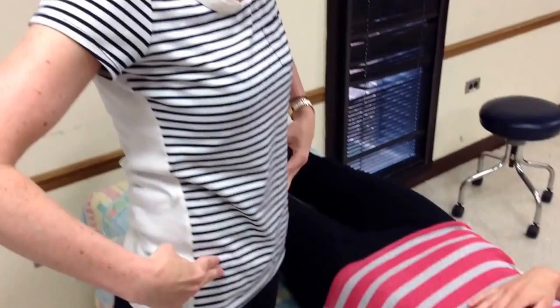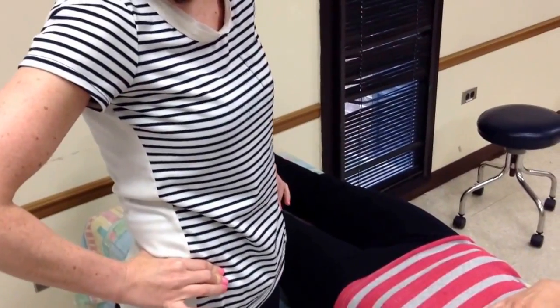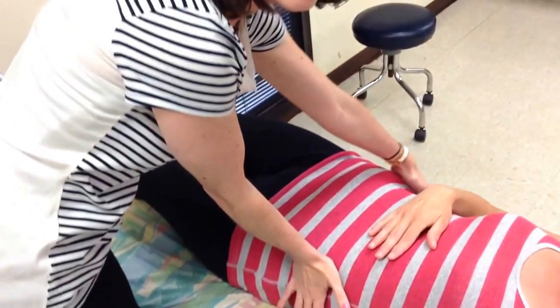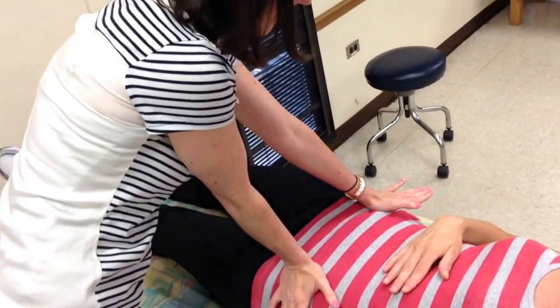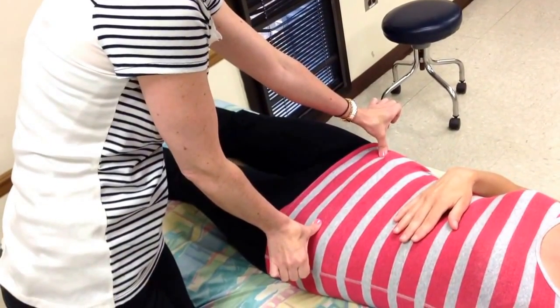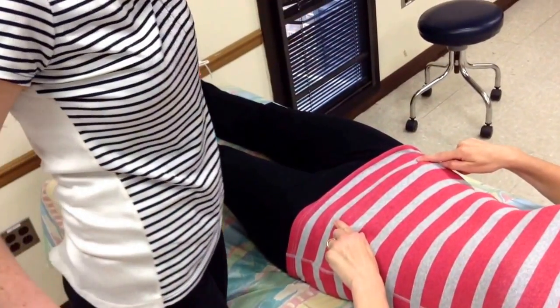So I'm going to point to my own and say to the patient: Suzanne, I'm going to touch these two hip bones that stick out in your hips — is that okay? I'm going to use my thenar eminences, fingers outstretched and away from the patient, coming in a little higher to err on that side until I palpate the ASISs. Then I'll put my thumb there and say: Suzanne, I want you to take your index finger on each hand and put them right on my thumb. So now the patient is pointing out exactly where her ASISs are.